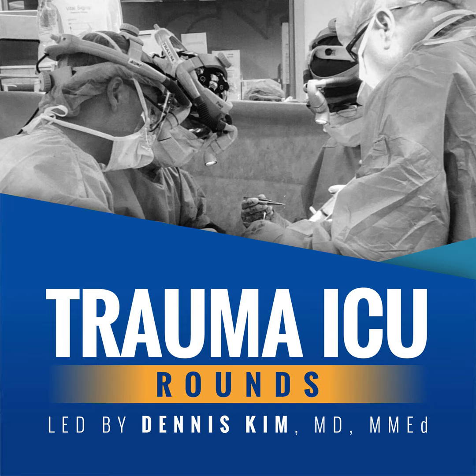And our protocol here is to typically do it first thing in the morning. But that's not to say that we can't extubate patients at any time of day or night. A lot of this is going to be directed by what sort of help and resources are immediately available, as well as the comfort level of the RTs, RNs, and ICU staff, as well as faculty.